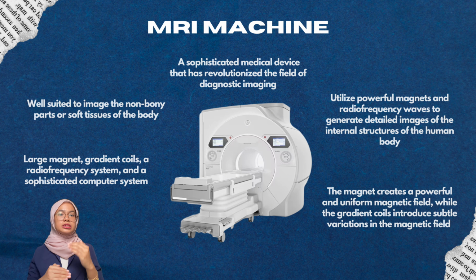The MRI machine consists of several essential components, including a large magnet, gradient coils, a radio frequency system, and a sophisticated computer system. The magnet creates a powerful and uniform magnetic field, while the gradient coils introduce subtle variations in the magnetic field to enable spatial encoding of the signal.